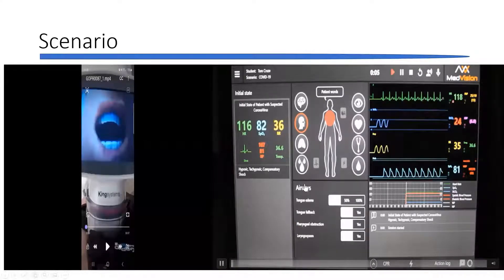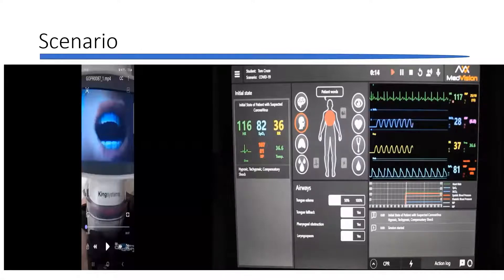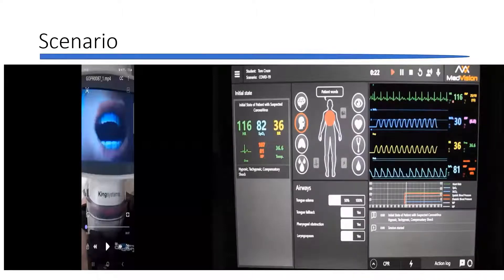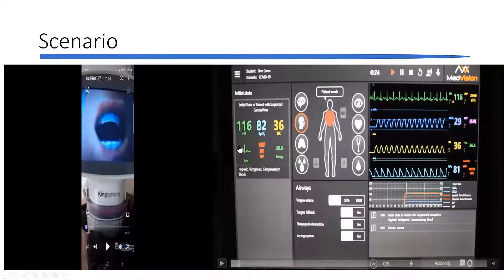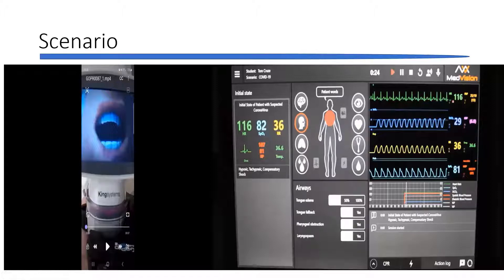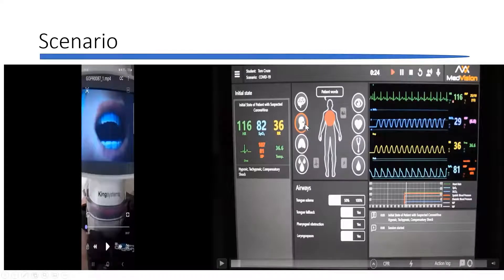This is the program that you saw — it's running now, live, started here. If you recall, in the program features at two minutes we're going to have an action change, and again at three minutes after that. As you saw in the program, the heart rate, SATs, initial presentation, blood pressure, and temperature are within this feature. For the brain, as they have it, this user interface or software is super easy. This is where you'd find seizures — Leonardo does have tonic-clonic capability for convulsions or seizures. He has trismus, where they can lock down his jaw.